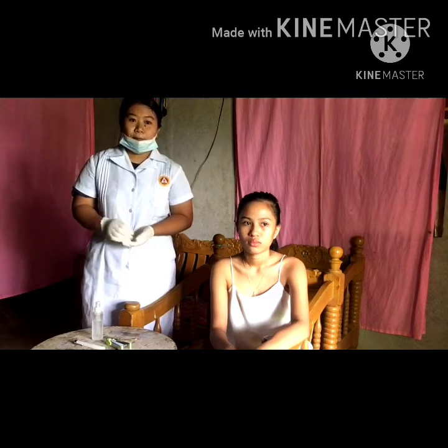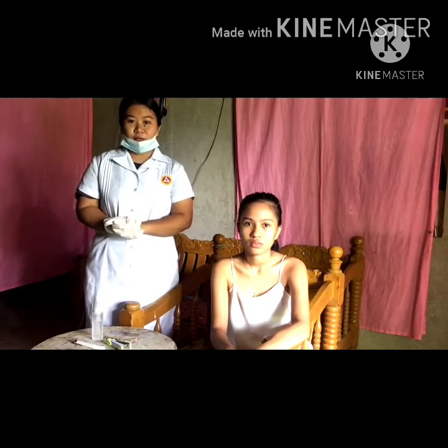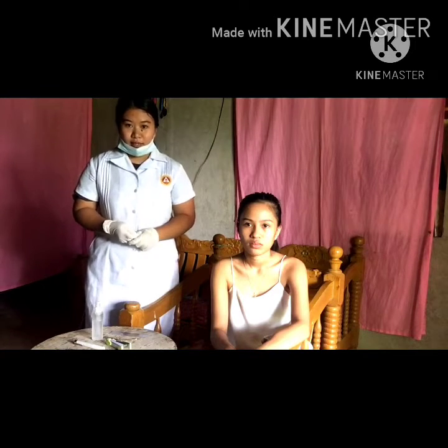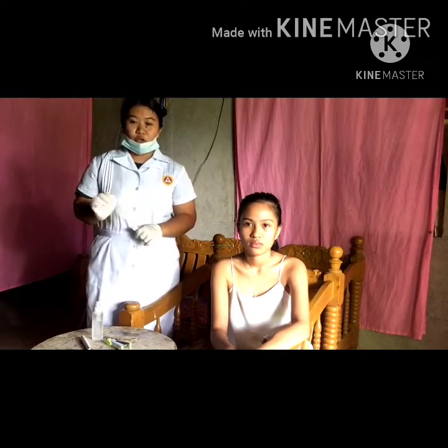And number 2 is palpate the external ear. For normal findings, the auricle is non-tender. And number 3, palpate the mastoid for tenderness, temperature, and edema, and then use the otoscope. For the normal findings, there is no tenderness or pain and no warmth.